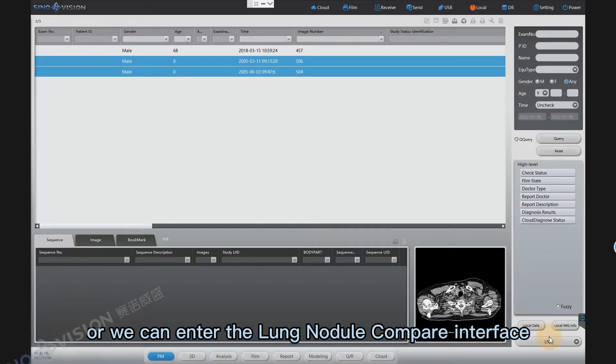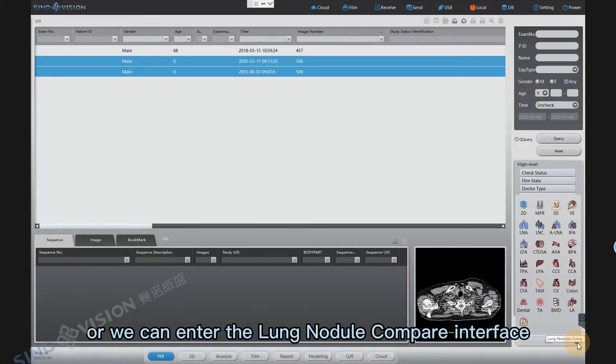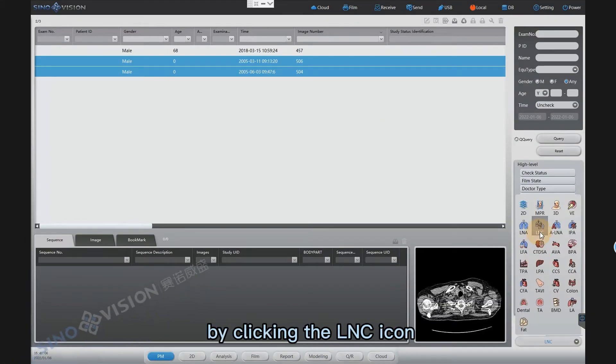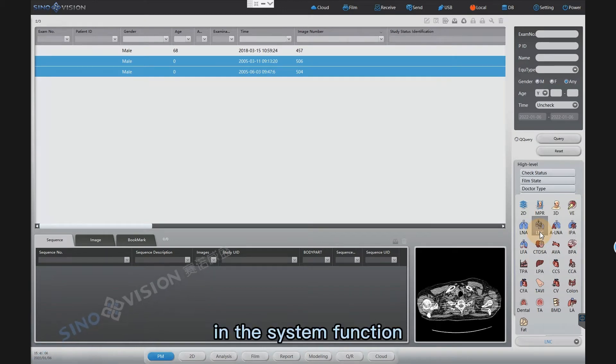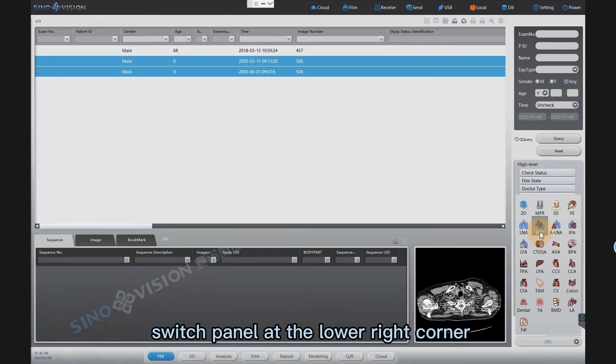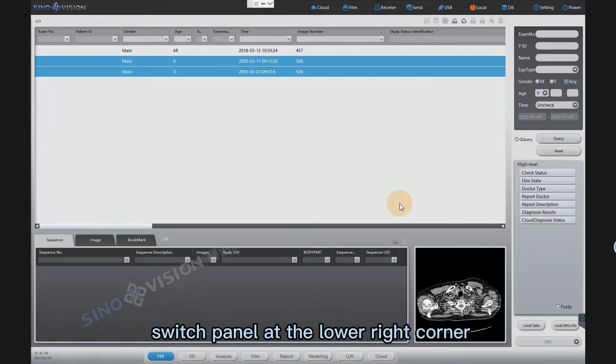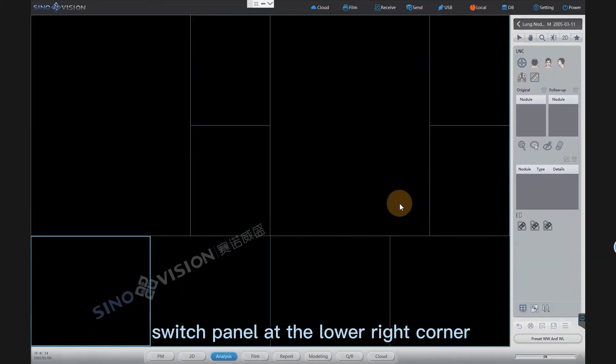Alternatively, we can enter the lung nodule compare interface by clicking the LNC icon in the system function switch panel at the lower right corner.